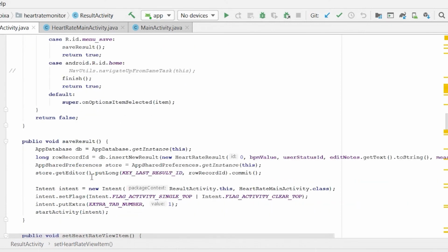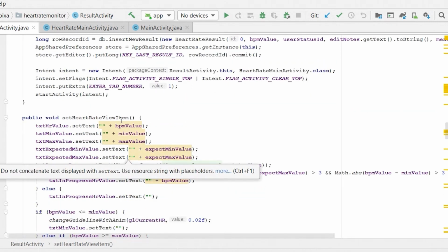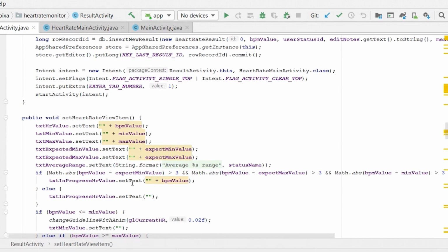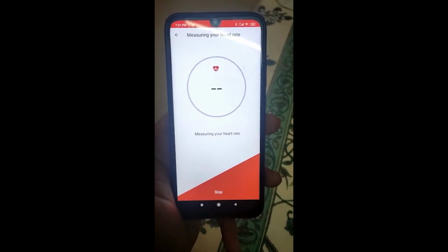Now, moving on to the save result function, we can also see the values are added to the database. In the set heart rate view item function, we can see the results are added accordingly to the range and shown on the screen of the app, where the average percentage is calculated accordingly. Now let's take a look at the demo section here.